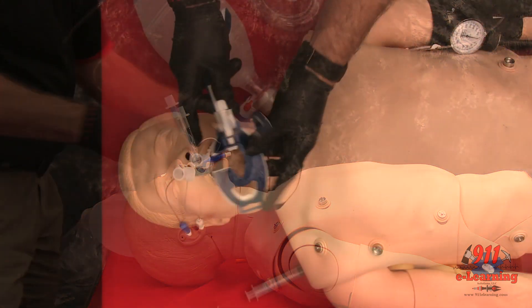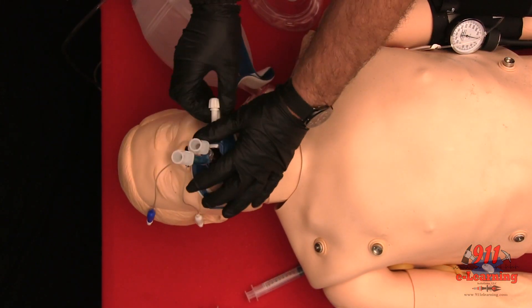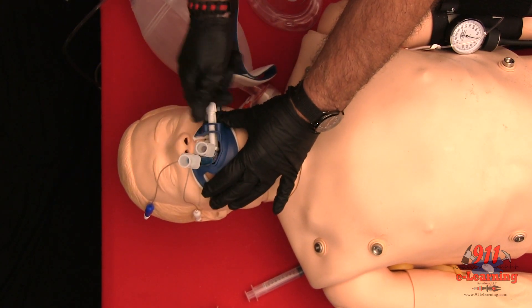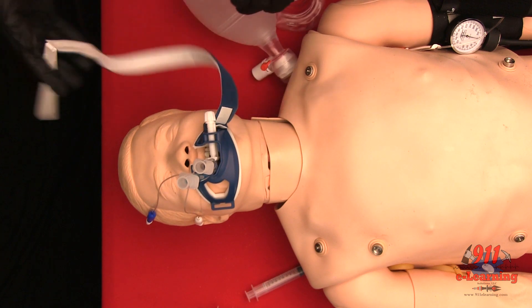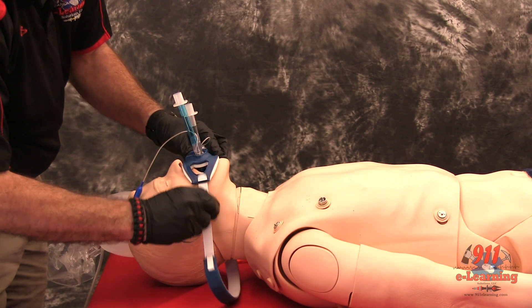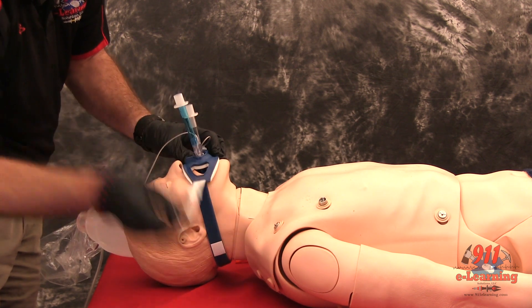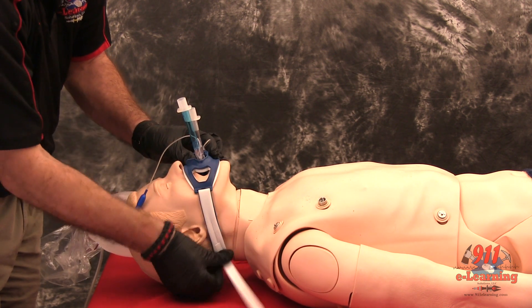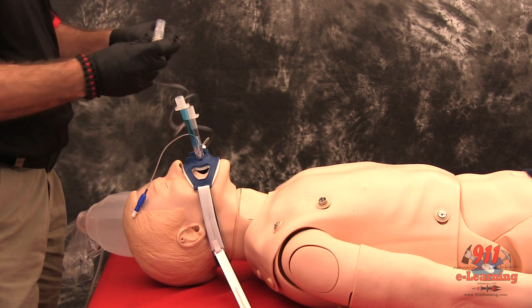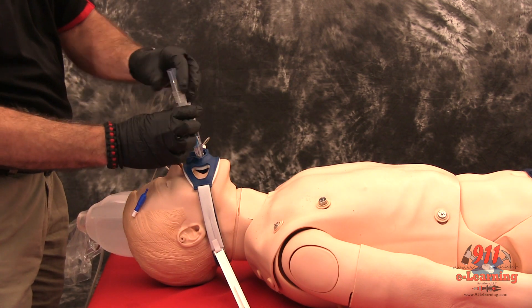Tape to secure or use a commercial tube holder. Confirm tube placement using an end-tidal CO2 detector or esophageal bulb device.